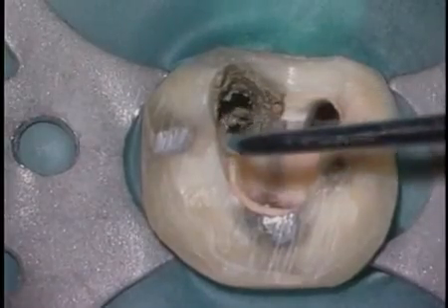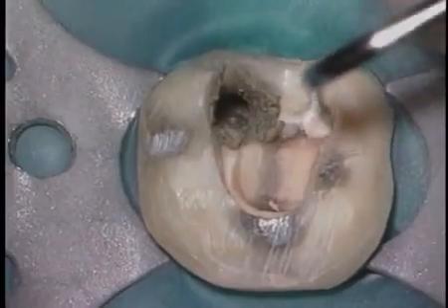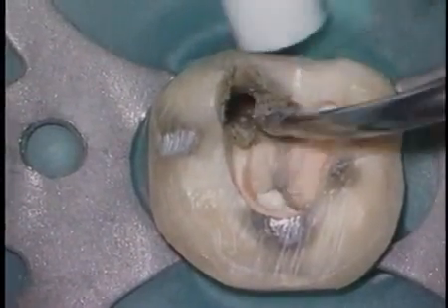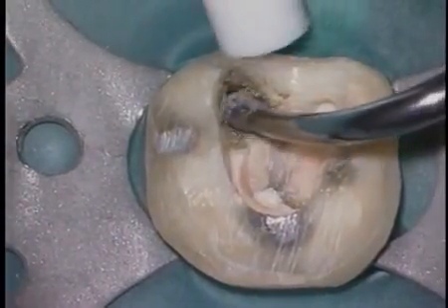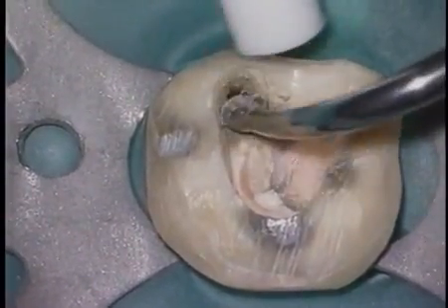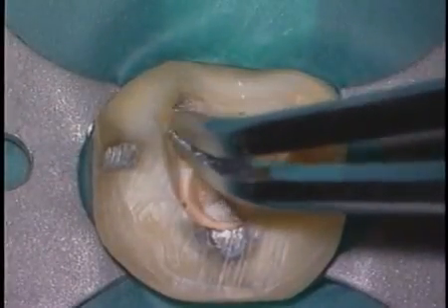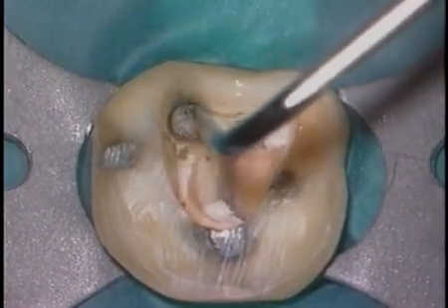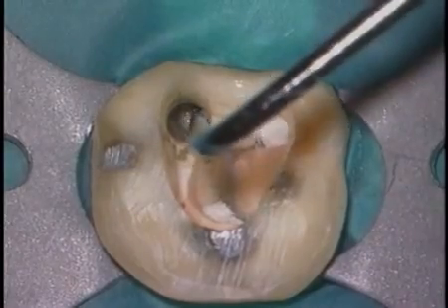We need to begin to start cleaning up the surplus MTA. There'll be too much in the canal. And remember, we're going to have to subsequently go back into this case and clean and shape, so we don't want to have MTA occluding the physiologic canal. Small spoons can be used, or you can use a cotton pellet that can be grasped with a barbed broach, and this will not only clean the walls, but the wet cotton pellet will tend to tamp and adapt and precisely close off the perf defect.